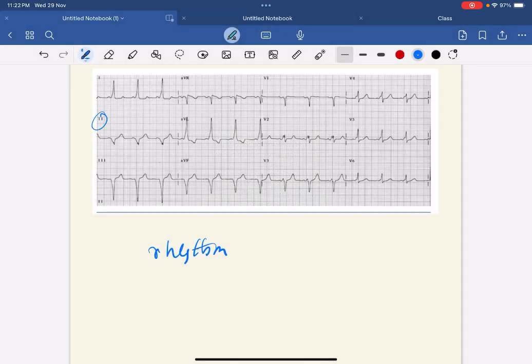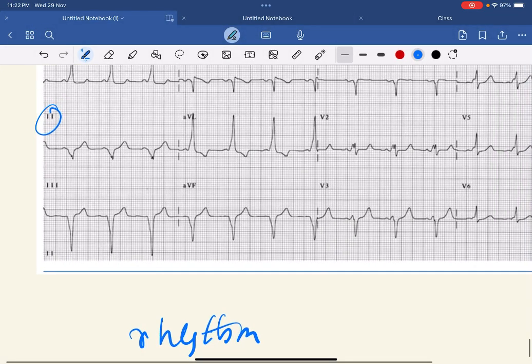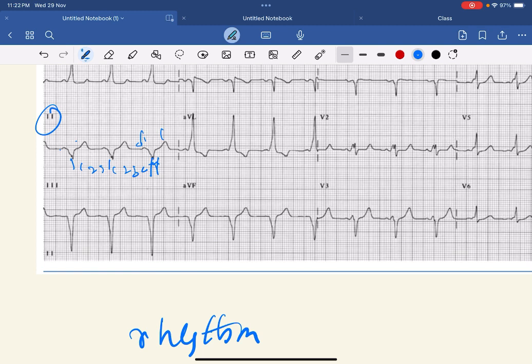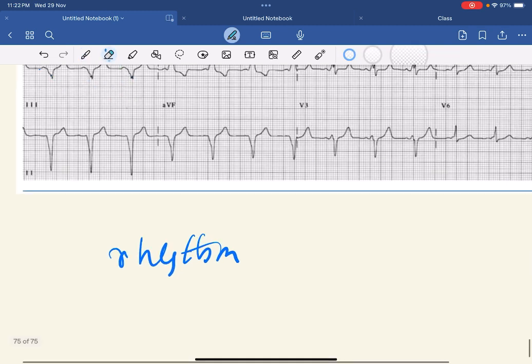In lead 2, there are P waves, QRS complexes, and T waves. Every P wave is followed by a QRS, and the RR interval looks fairly regular — 3 and a half, 3 and a half, 3 and a half — so it is quite regular. Therefore, it is normal sinus rhythm.